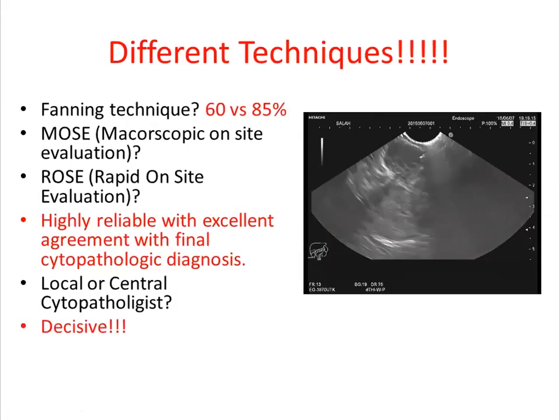In many instances, I send the patient to someone, and the biopsy is inadequate, bloody, hemorrhagic, and when I repeat the cytopathology with an experienced one, that is called rereading or second opinion, it proved to be malignant and it proved to be cellular. So I think cytopathology all over the world is a special art.